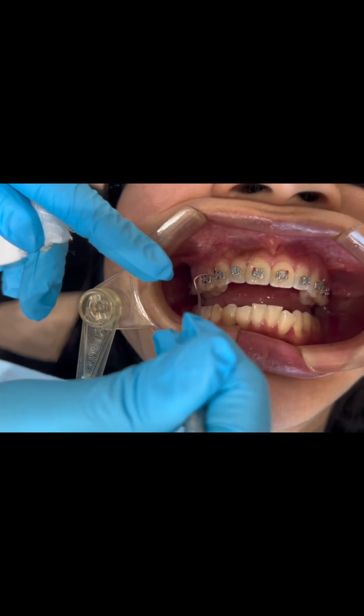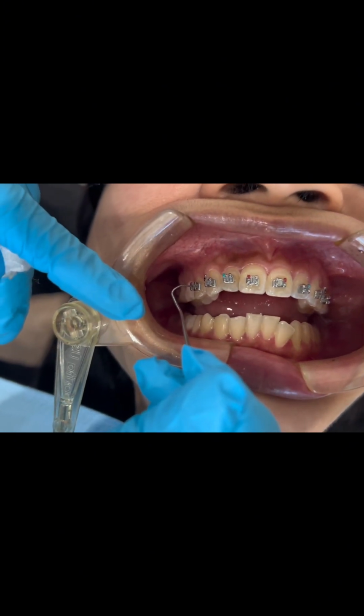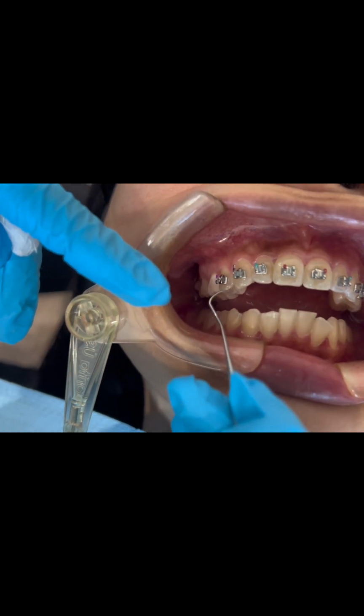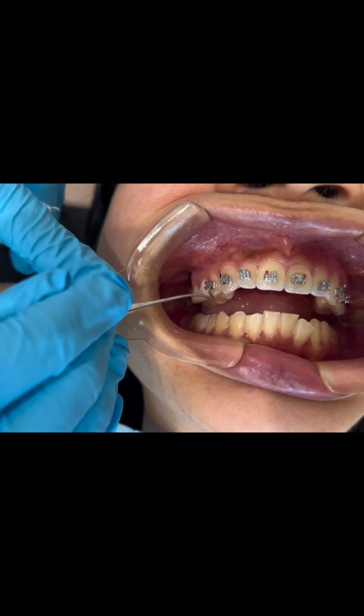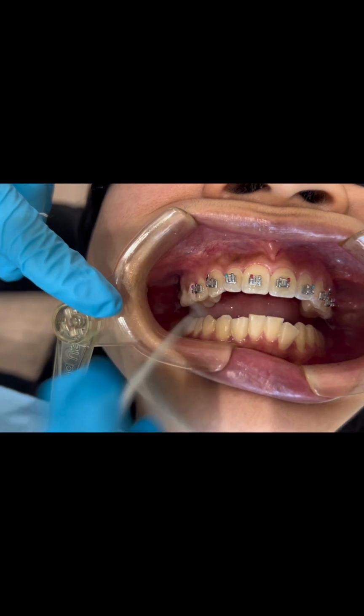All right, just like this. You see, you're getting this, right? Just like that, all right? And so now I'm gonna just kind of let him know that I'm ready. Ready to bond. Just like this. And if he weren't coming right away, we would cover it, just like this, until he can.